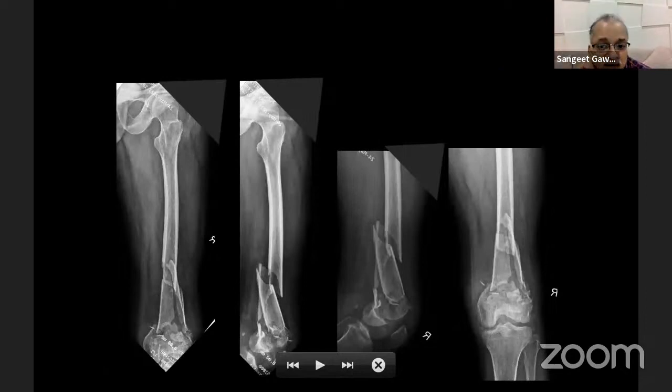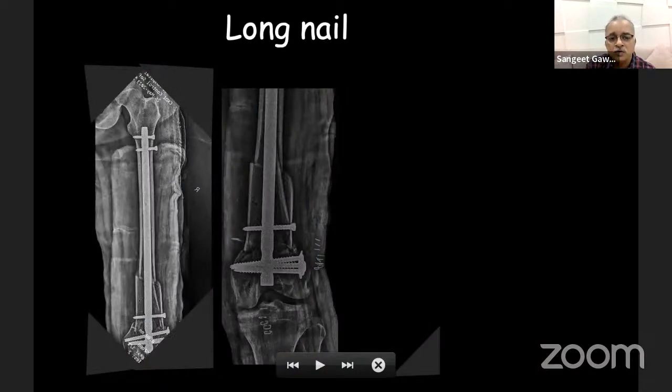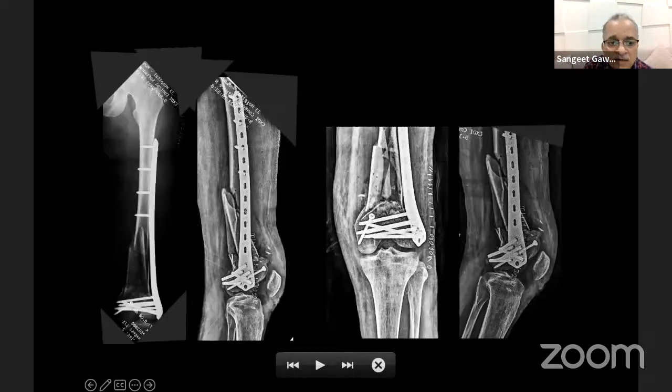Another situation where you have to carefully choose the implant: the surgeon thought that in this fracture, the ideal implant would be a nail, which he tried to use along with interfrag screws to fix the intercondylar area. And look what has happened in the lateral view. The entire nail along with the proximal fragment has moved out. And what is left behind is the two condylar fragments. And that required revision with a plate, the longest plate available at that time. So this has to be revised.